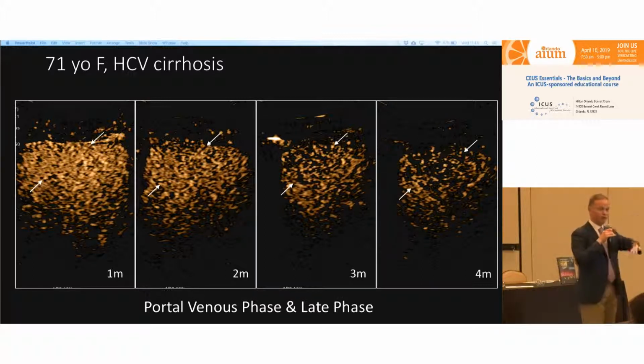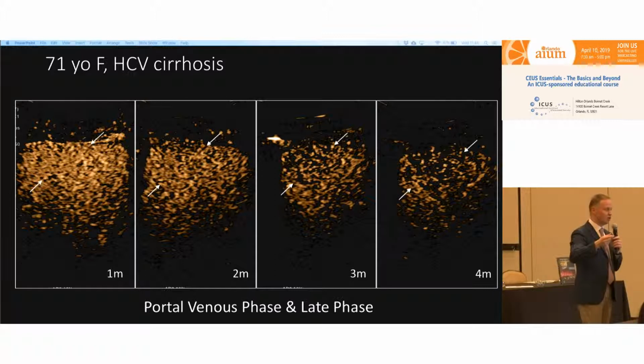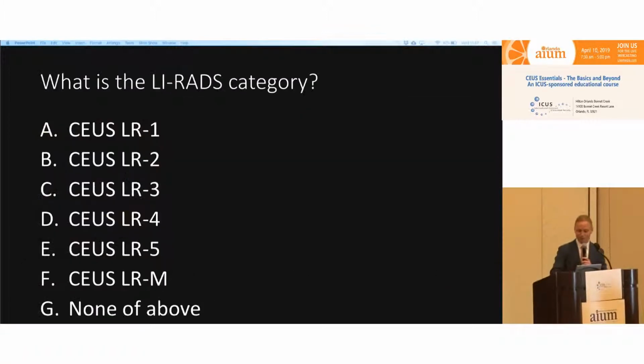So I cover the freeze button with my hand, because their immediate knee-jerk reaction after I said contrast image complete is to start acquiring imaging. So I cover the freeze button so they can't do anything. But I ask them to hold their hand on the patient, so when we do need to go back, they're already on the lesion, and this helps tremendously. All right. You see, we turn an easy case into something more exciting in absolutely no time.